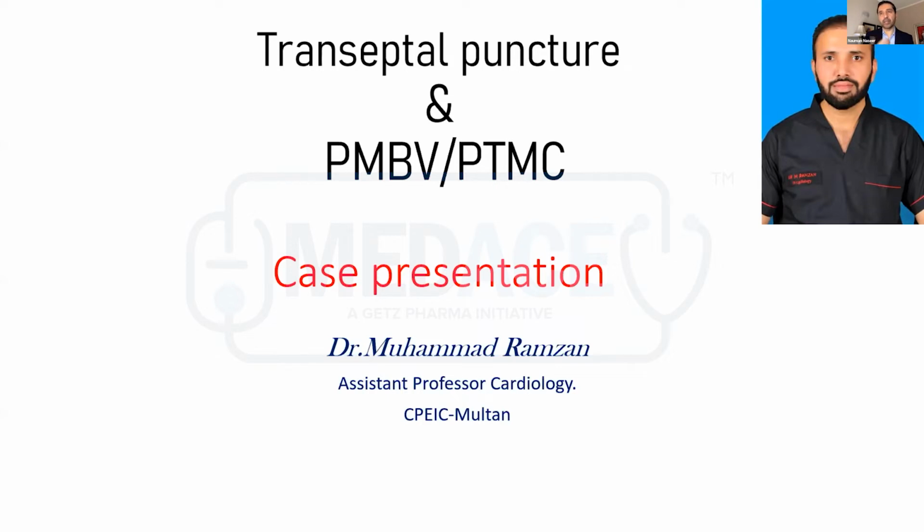So especially now with left atrial appendage closure and mitral clip, you want to be more precise about the puncture site where you're entering, and it's more helpful. So, for our PTMCs, we're not using the TEE. If there are any comments from the panelists or the speaker, that'll be great. Dr. Badar, any thoughts on why TEE is not being used routinely?